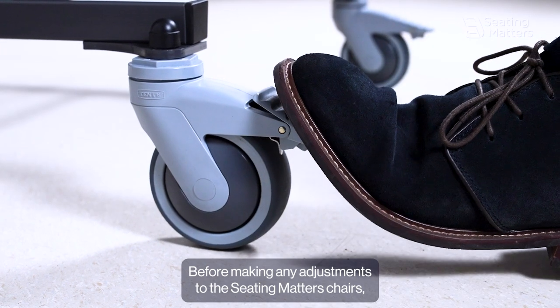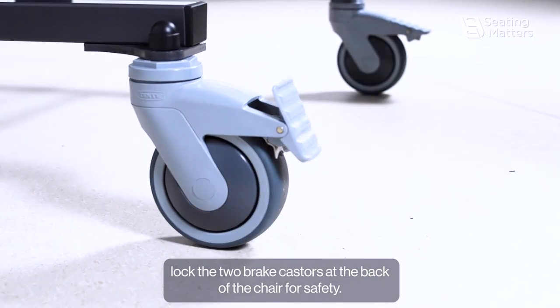Before making any adjustments to the Seating Matters Chairs, lock the two brake casters at the back of the chair for safety.